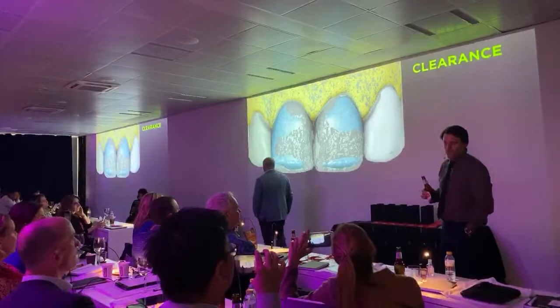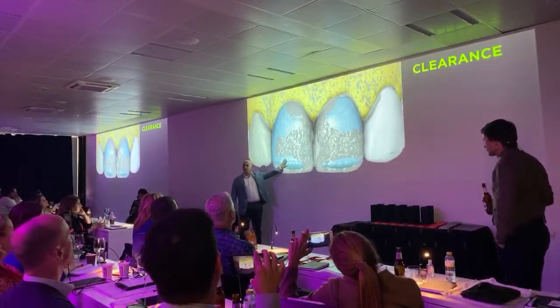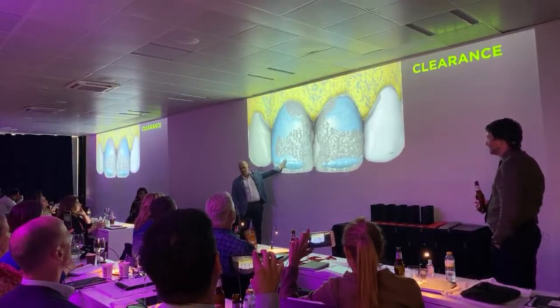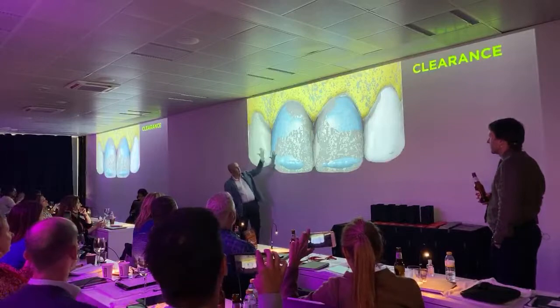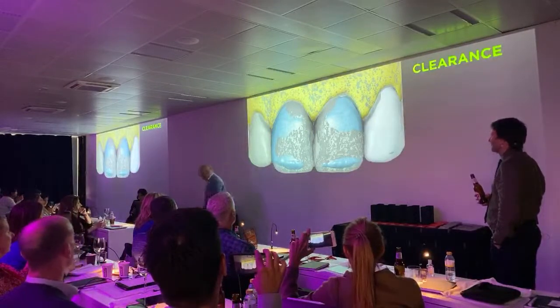Tooth color, prep color. These areas in blue are the minimum thickness for milling, 0.3 normally. So if you don't prep enough, if you don't have the clearance, we need to change the design, everything to buccal. So it's terrible, okay?